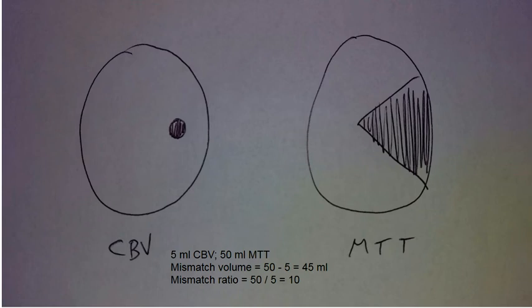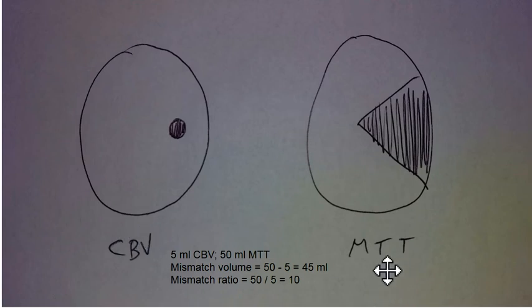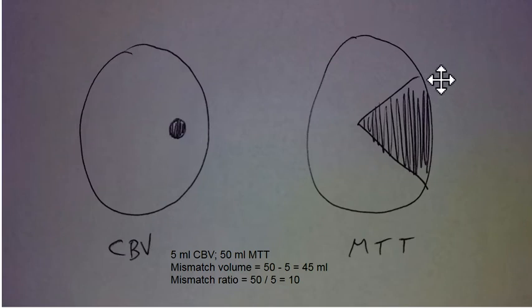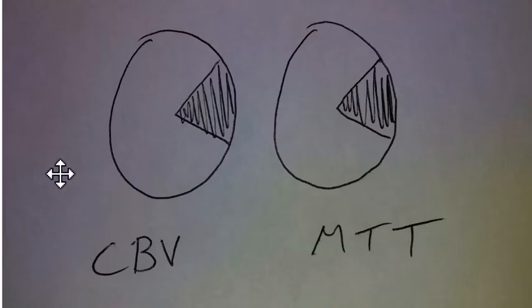Welcome back to part two of my talk on how to interpret CT brain perfusion studies. This figure shows the CBV map versus the MTT map. Notice there's a small defect on CBV and a moderate-sized defect on MTT. That shows this is a small core infarct with a moderate amount of surrounding potentially reversible ischemia.